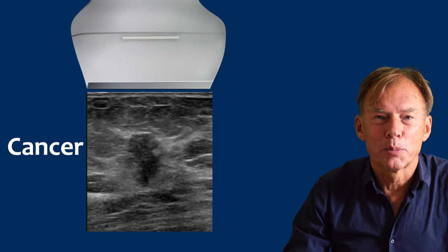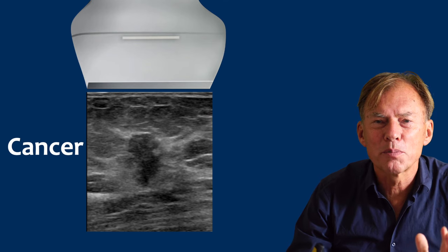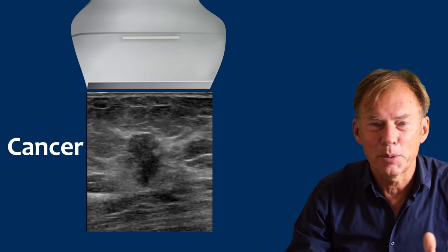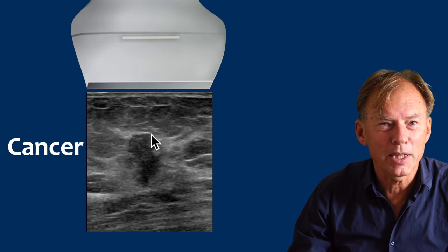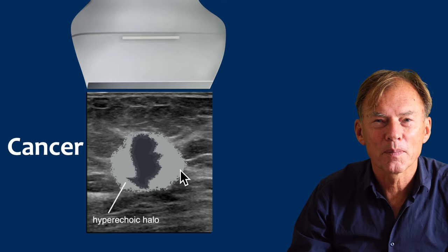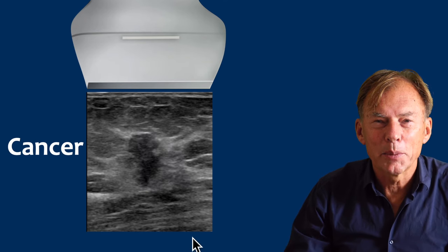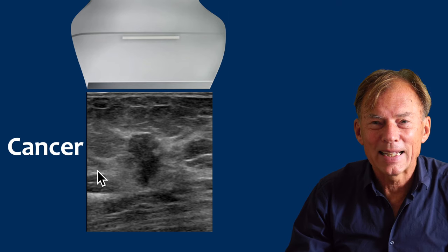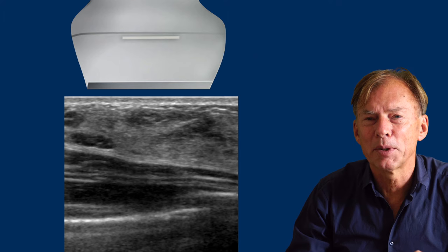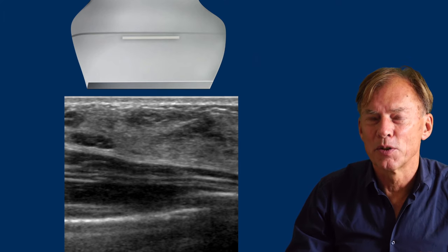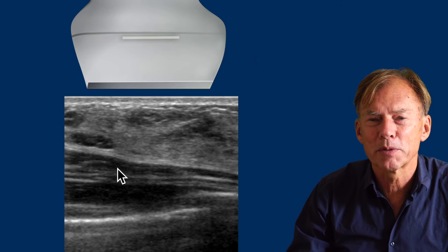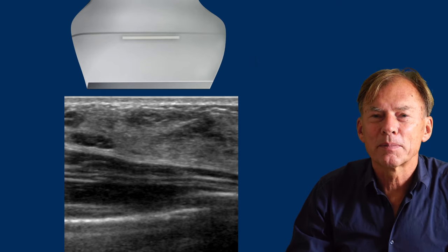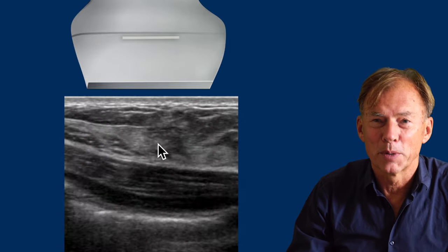Here is an example of a typical breast cancer — diagnosis made in a split second. It is hypoechoic, irregular, with an indistinct border, and notice the hyperechoic halo. Here we have normal tissue, and then it stops — this is all cancer. Here is another example where on this image everything is normal: the skin, mostly glandular tissue, pectoral muscle, ribs and lung — but here is a small breast cancer.